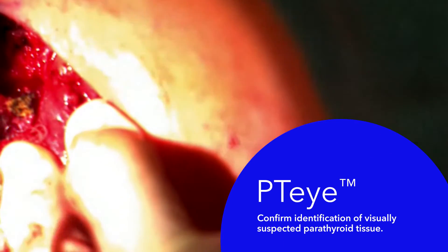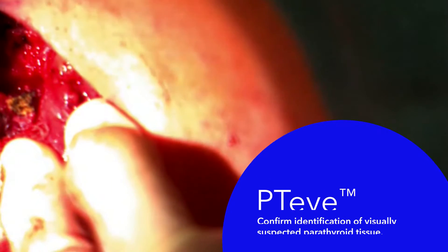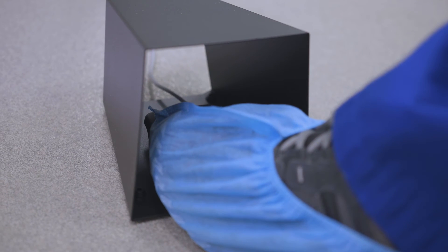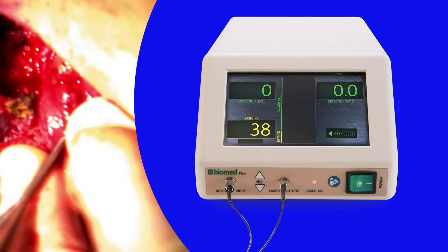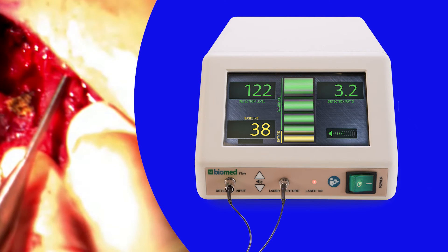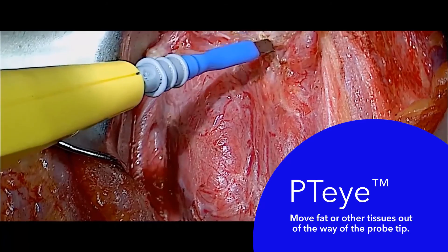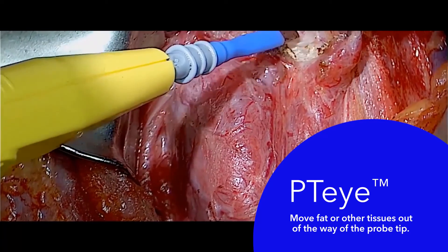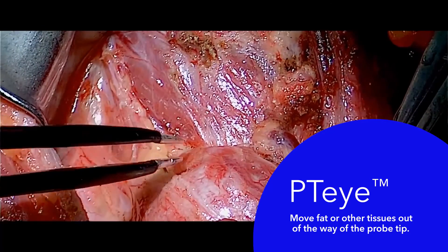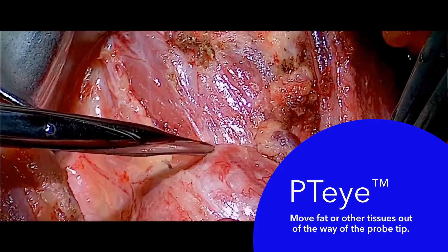Once suspect parathyroid tissue has been located visually by the surgeon, the PTI can be used to confirm identification of the visually identified suspect tissue. Press the foot pedal to keep the laser active. Using the probe, gently apply the tip to make contact with the suspect parathyroid tissue. Ensure the probe is held on that one spot for at least one second to ensure accurate measurement. Note that if suspect parathyroid tissue is covered by fat or other tissues, the fat and tissues must be manually moved out of the way, or the probe maneuvered around these tissues to make direct contact with the area of interest.